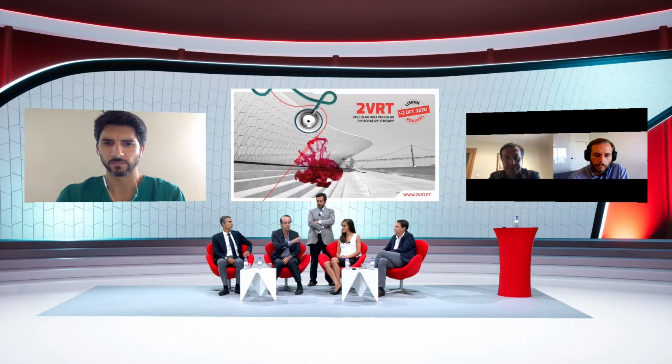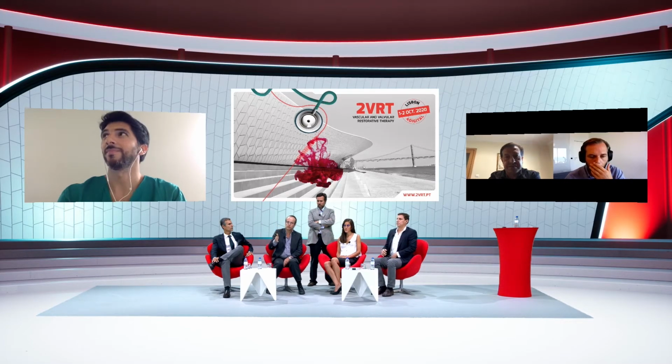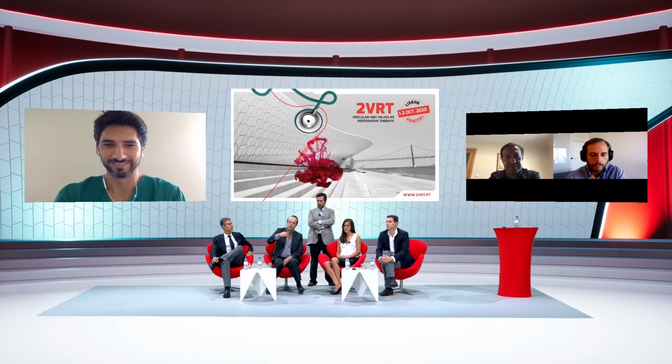We had a case a few years ago where we lost a patient because we went for the strategy of strong wires, very strong wires, and we ended up rupturing the LV. So I don't like to go up on wires when the problem is tortuosity, because I lose control of the left ventricle.